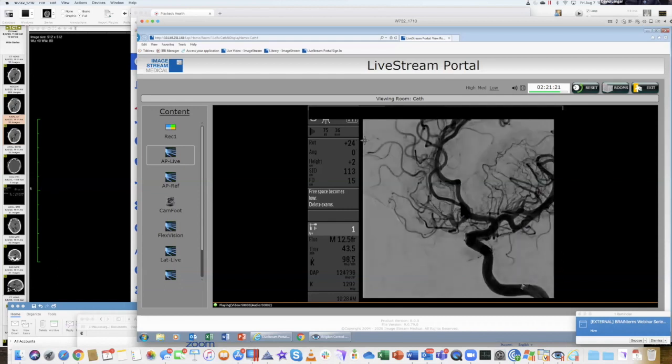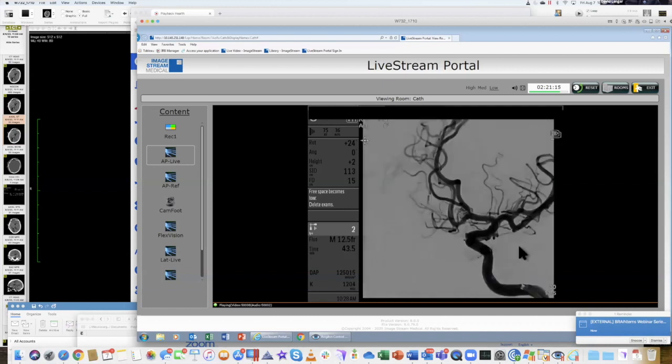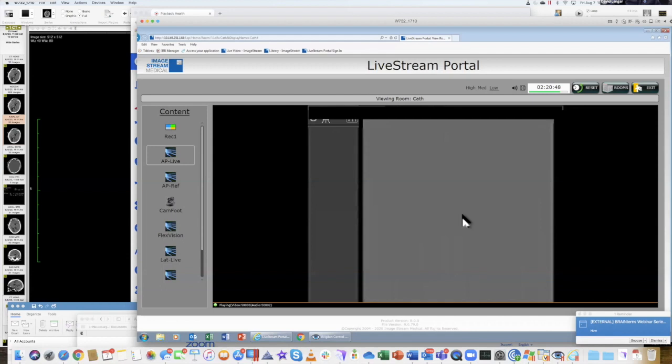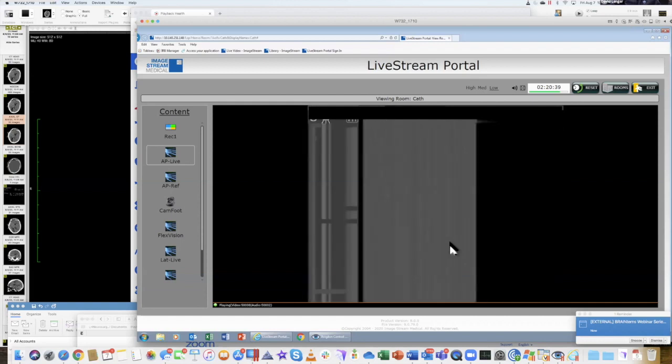That looks great. See, there's almost no filling of the aneurysm anymore. I was worried. See this right here? It looks like there's not as much contrast in this artery as this one. Sometimes the coil blocks the entrance, and that could slow flow, but this is actually washout from the other side. The right carotid is filling these arterioles. You're not seeing it, it's over here, but the right internal carotid connects to that complex. Because blood is filling that vessel, it doesn't have contrast in it, so you get that washout appearance in the artery. So I was asking Rafa before.